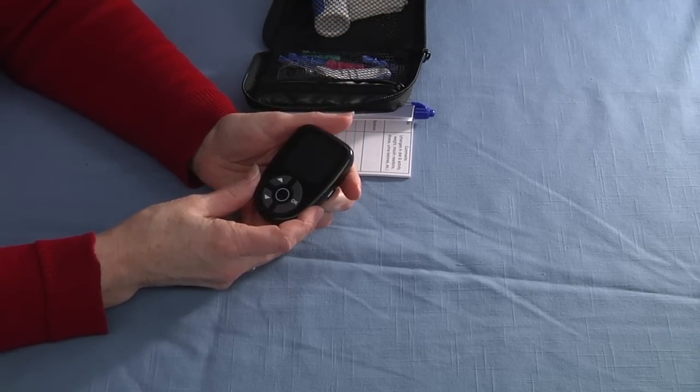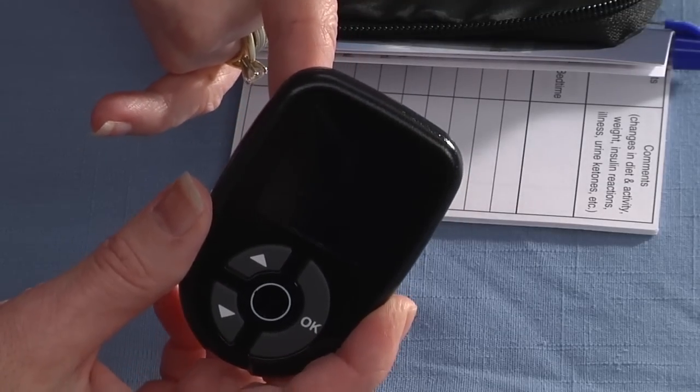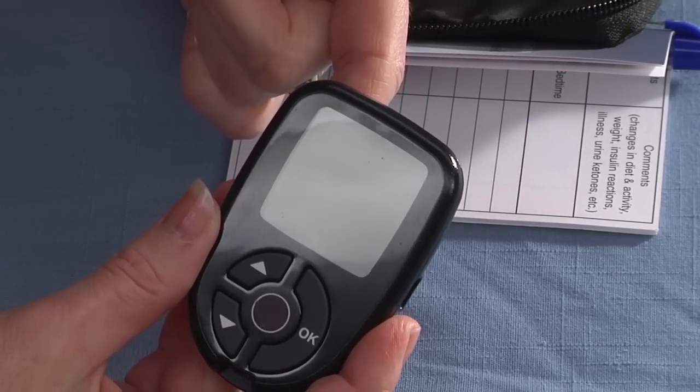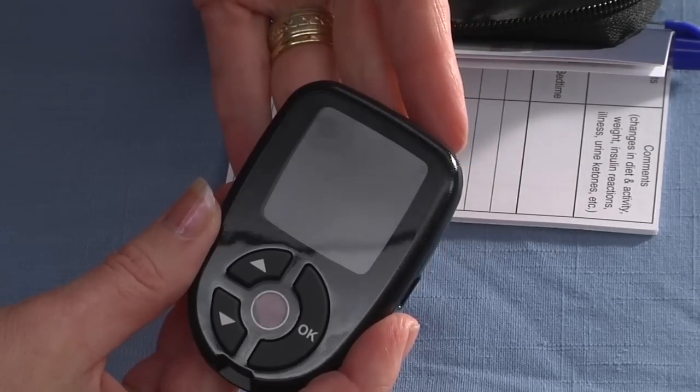A couple of things I want to point out about your meter is that there's an 800 number on the back of your meter. If you have any problems with your meter, simply call the 800 number on the back.